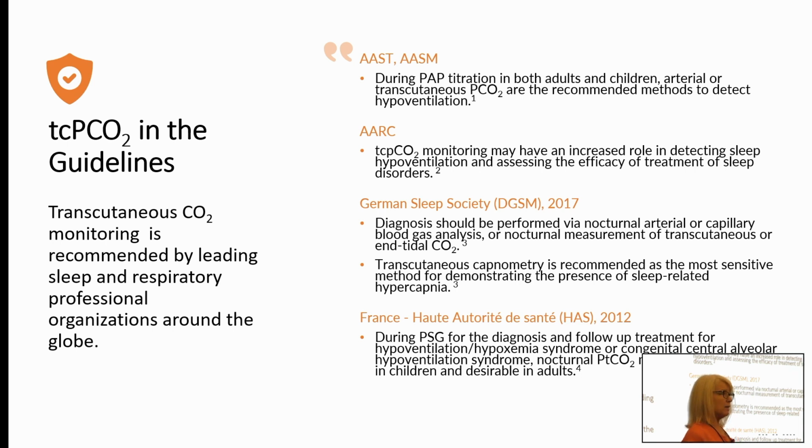It's not only recommended by organizations here in the United States, but it's also recommended by respiratory and sleep organizations globally. So in addition to the AARC and the AAST, the German Sleep Society states that diagnosis should be performed via nocturnal blood gas analysis or via nocturnal measurement of transcutaneous or end-tidal CO2. So what they're saying is, yes, please look at your CO2. But they go on to say that transcutaneous technology is recommended as the most sensitive method for demonstrating the presence of sleep-related hypercapnia.